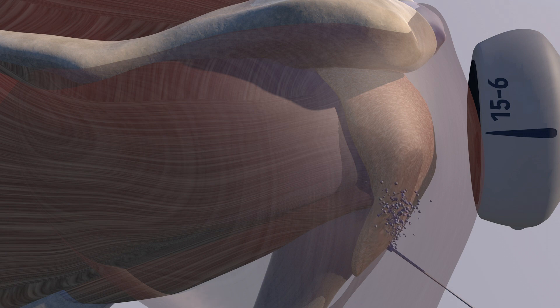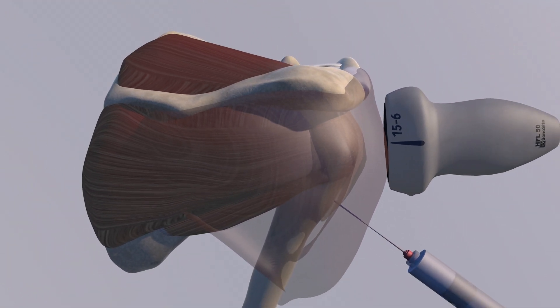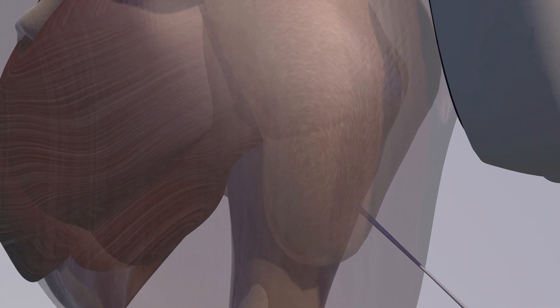Here's our initial attempt where we were a little bit superficial to the bursa. You can see how the needle is essentially just superficial to the bursa and the injectate is pushing the bursa in somewhat. Now we're going to advance the needle a little bit more into the bursa itself, and now you can see how the bursa expands with the injection.